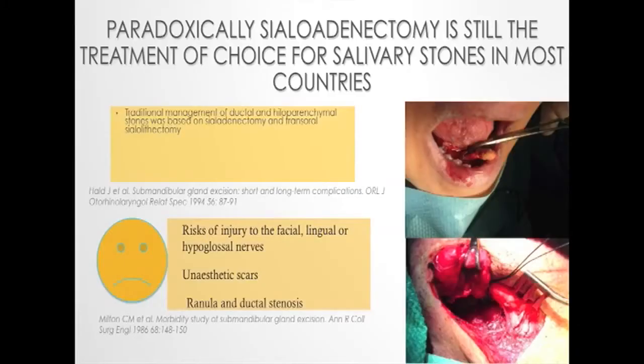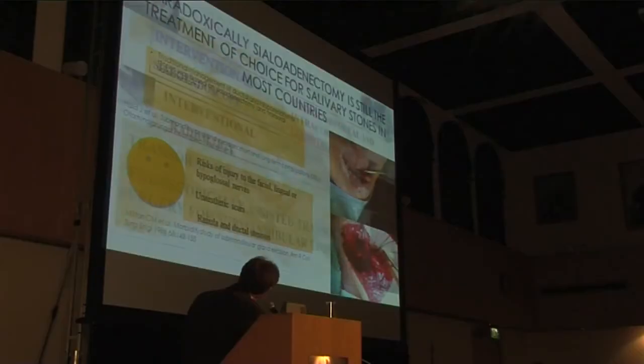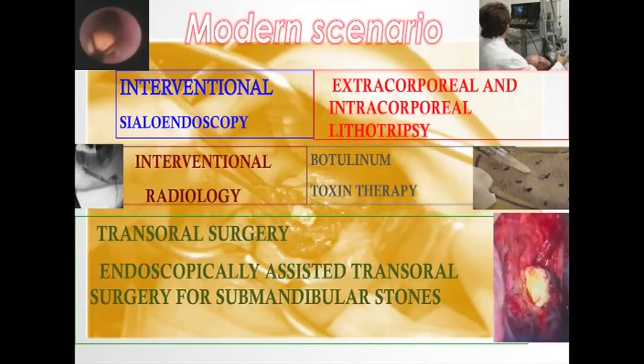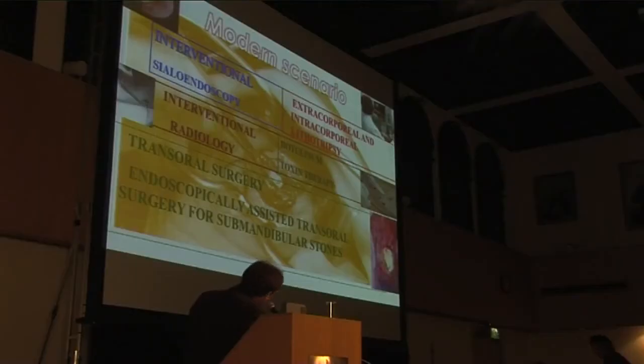With regard to therapy, paradoxically, sialoadenectomy is still the treatment of choice of salivary stones in most countries. But now we have a modern scenario that is full of opportunities such as interventional sialendoscopy, extracorporeal and intracorporeal lithotripsy, interventional radiology, botulinum toxin therapy, and finally transoral surgery and endoscopically assisted transoral surgery for submandibular stones.